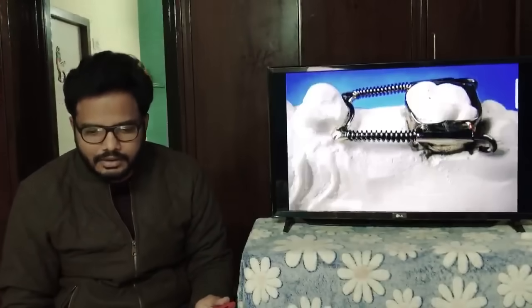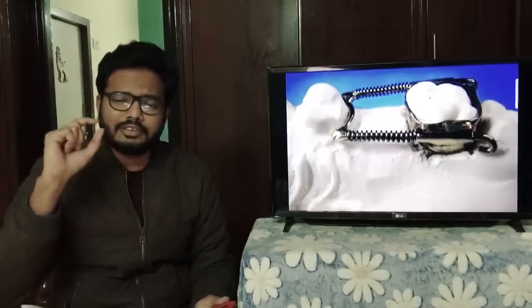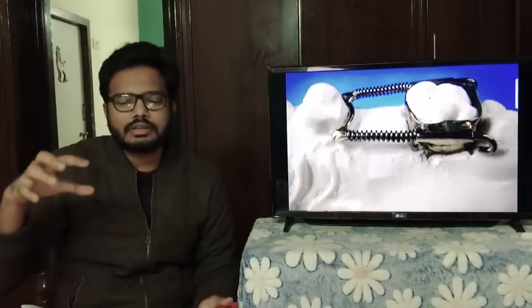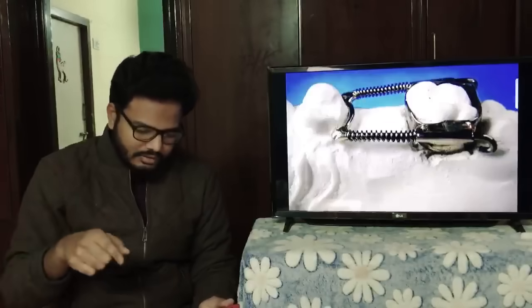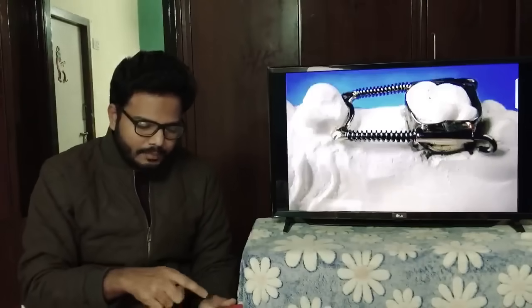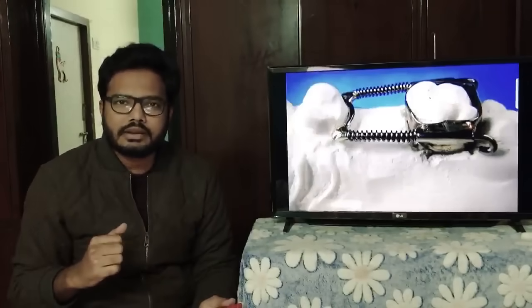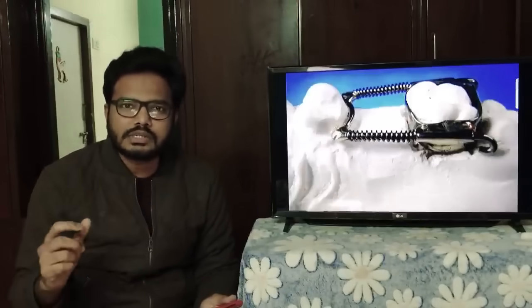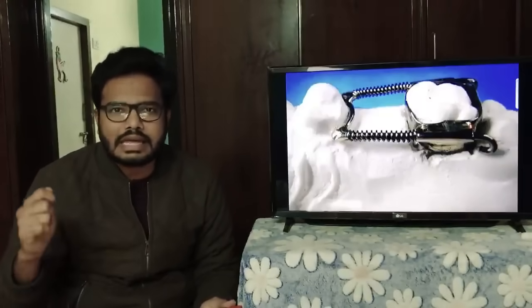So it's nothing but a Gerber space regainer. It's not a space maintainer, it's a space regainer based on the coil spring. We have either a crown or a loop which is attached to the tooth which has to be distalized, and then a U-shaped rod and a hollow tubing soldered to the mesial aspect of the molar, with the base towards the tooth which is mesial to the edentulous area. We have a coil spring which is compressed and placed, and this generates forces which enable distalization of the molar in this case. Gerber space regainer.